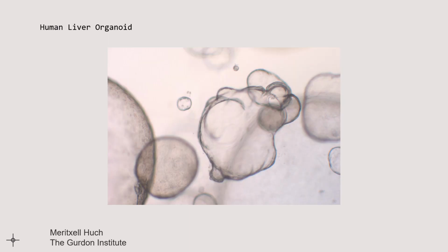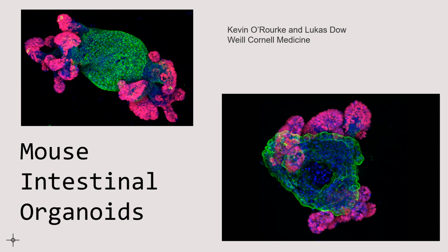So my next part is I just want to show you a few pictures of the actual organoids. This one here is a human liver organoid. This organoid was derived from a biopsy from a healthy liver donor. This is showing how it expanded in a culture and how there's a budding process so it's able to replicate. This is my second image, and I thought it was really cool. This is mouse intestinal organoids, and these were actually once growing as cancer, but now they are able to undergo a certain type of differentiation and are actively dividing stem cells now.